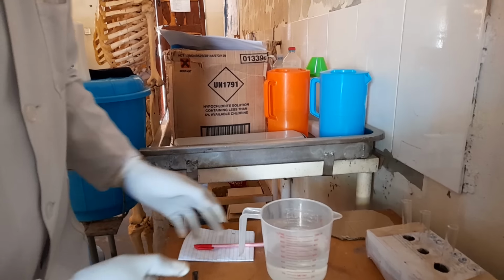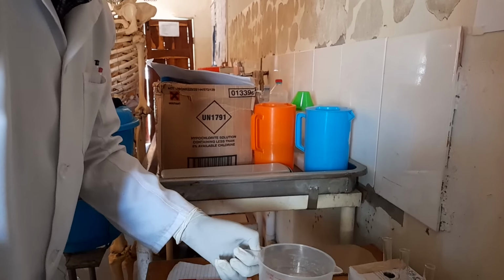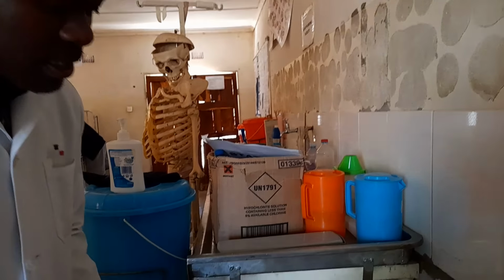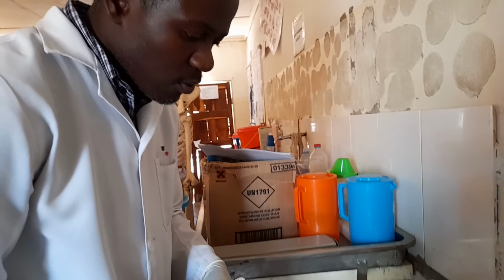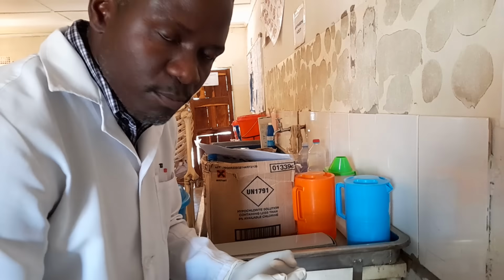After that, you're going to have to smell urine. The normal smell of urine is aromatic, so you tell the examiner the smell is aromatic. Then you look at the color. The color of urine, you would say it's amber. You can just say straw amber. So that's the color. Now we have to go to the fourth property.